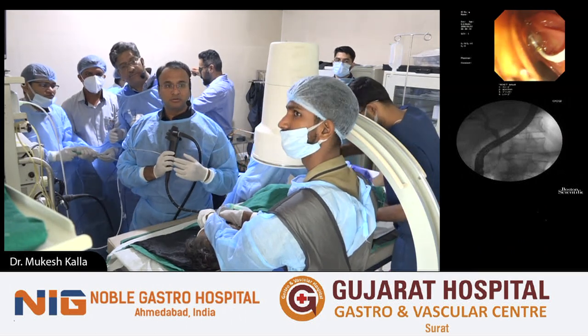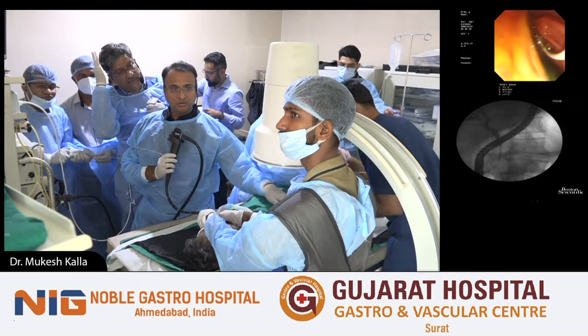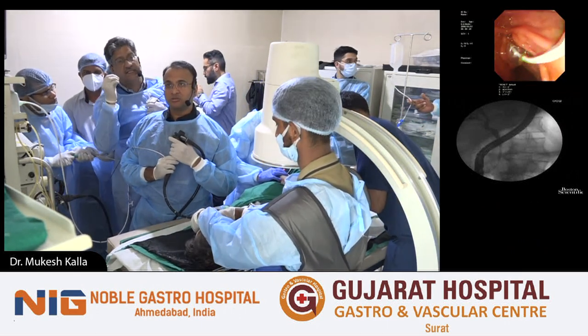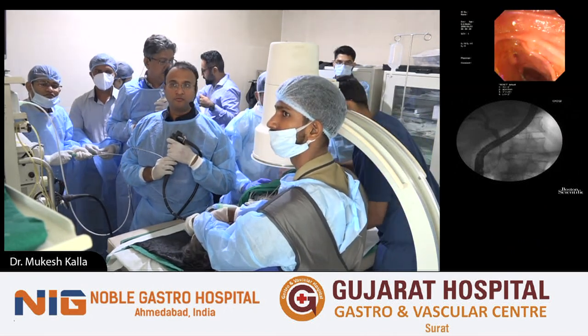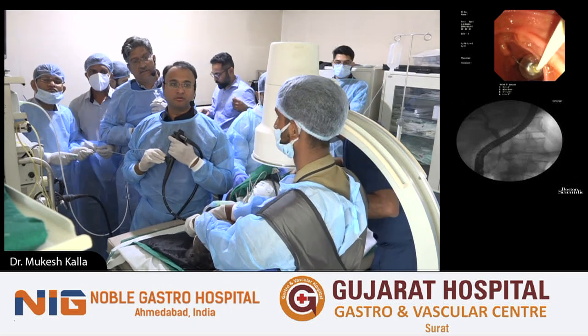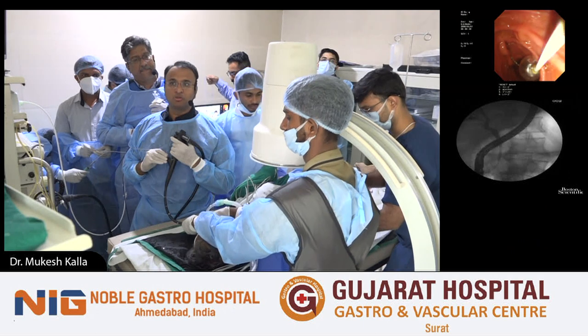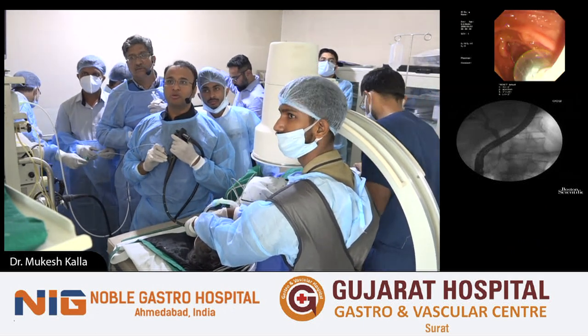You have three large stones, four large stones, take one after the other. You don't do endoscopy and do laser lithotripsy for 2 hours and do a second sitting and then a third sitting. Then a surgeon is a better hand in this situation. But if there is one large stone, or one large stone and two, three small stones, you don't go for surgery straight away. Then you do endoscopy.